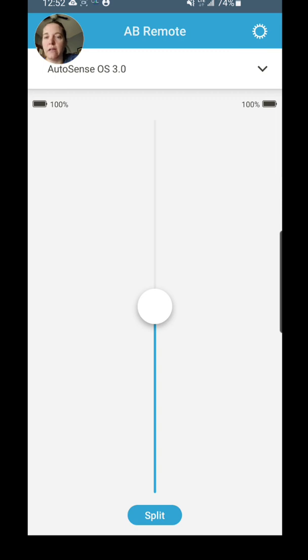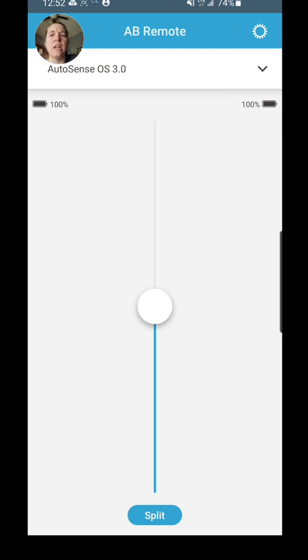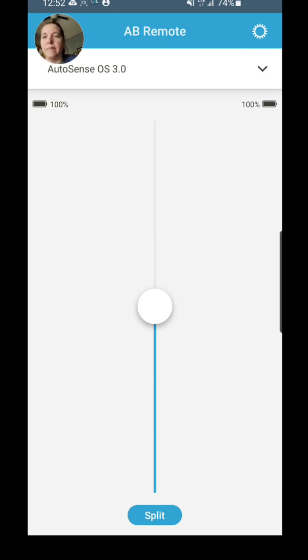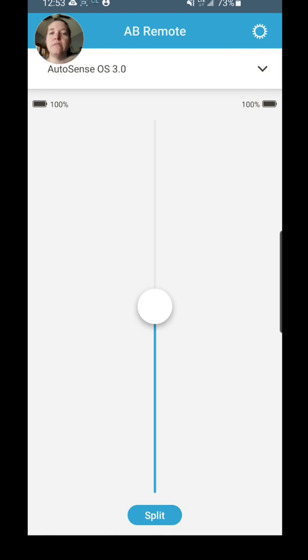You'll see the battery status up there. It essentially goes 100%, 75%, 50%, 25%, and then I think it goes 10 and 5 and maybe 2 before it completely dies on you. You'll see a little cog wheel up at the top—that is for additional options.